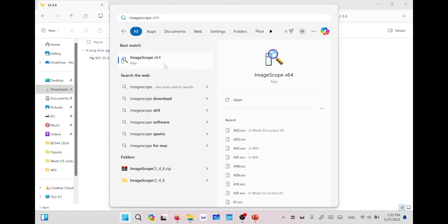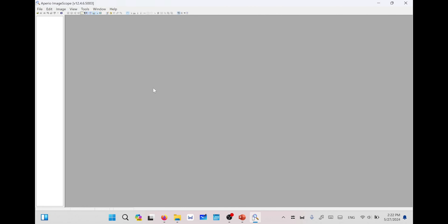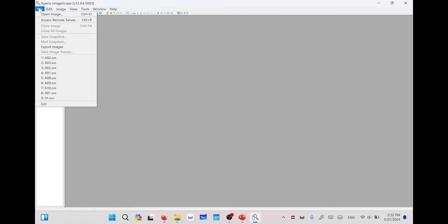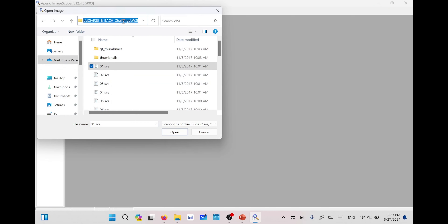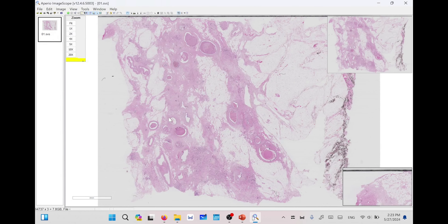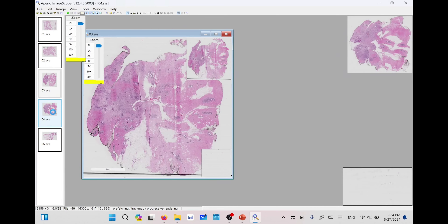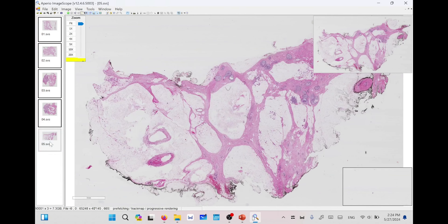After installing, you can search for ImageScope or find the shortcut on your desktop. This is the interface of the application — it's very simple with simple tools. You can add images from File and then Open Image, or press Ctrl+O. We are going to use the BACH dataset, which contains different whole slide images. Let's open the first five whole slide images with extension .svs. It will start to import each of them, and if you click on any of these images it will navigate to the corresponding whole slide image.